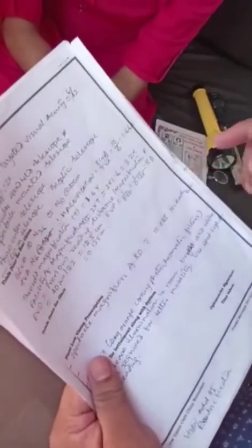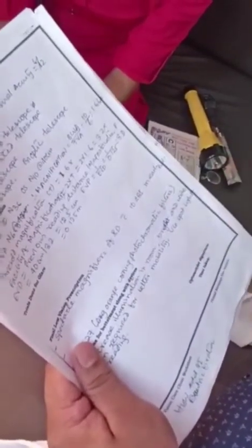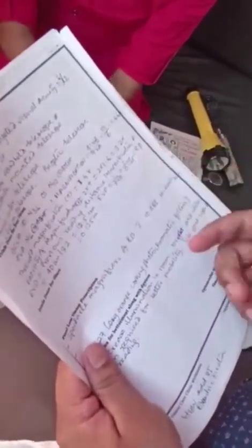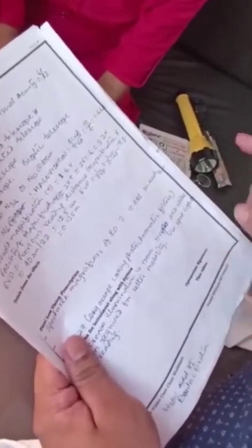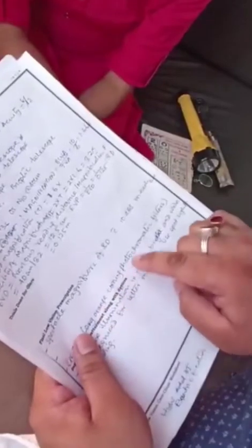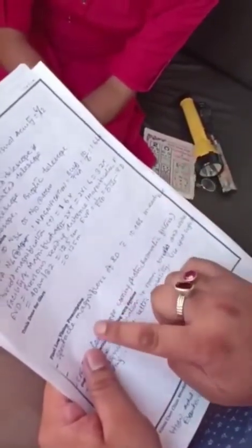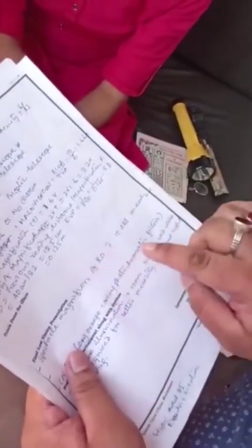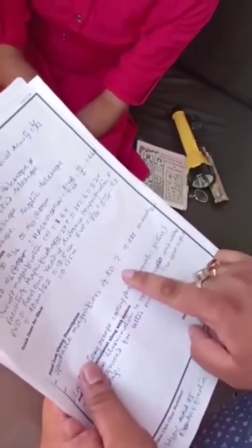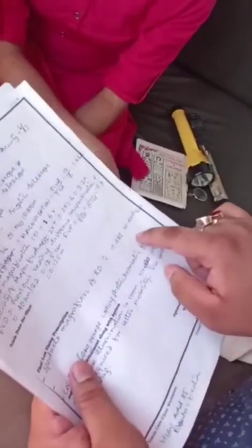But if we prescribe 8 diopter for near, we need a base in prism for her because her central vision is already gone. And second thing, to address the convergence demand, because if you put 8 diopter we have a high convergence demand, and that has to be compensated with base in prism only. So the rule for spectacle magnifiers, for example 8 diopter, is that we should add whatever magnification you are getting plus 2. So here we got 8 diopter plus 2 diopter. Now we can read with the correct magnifier.